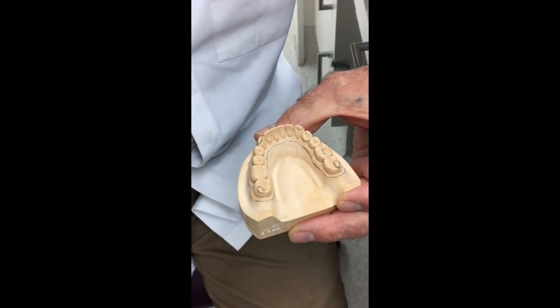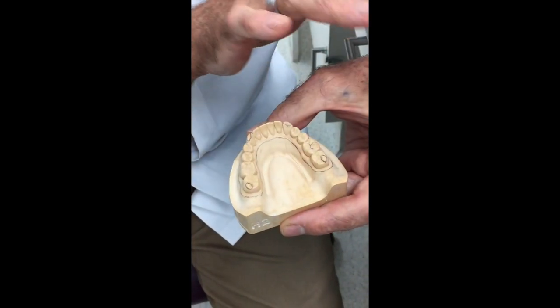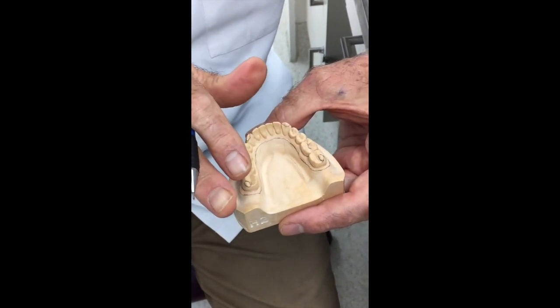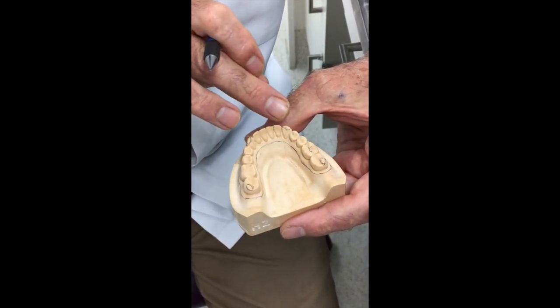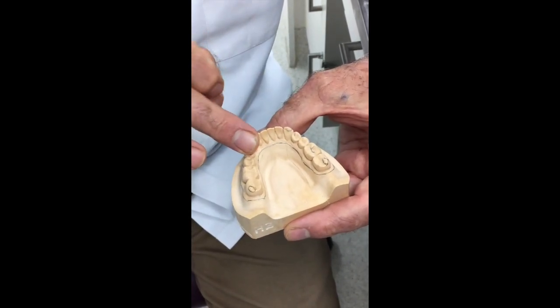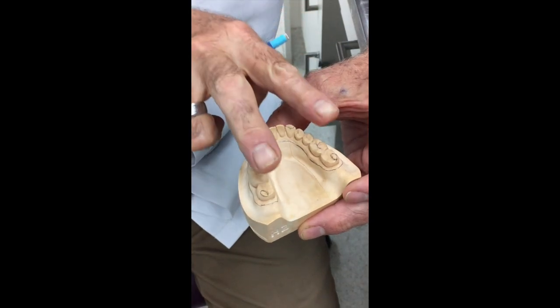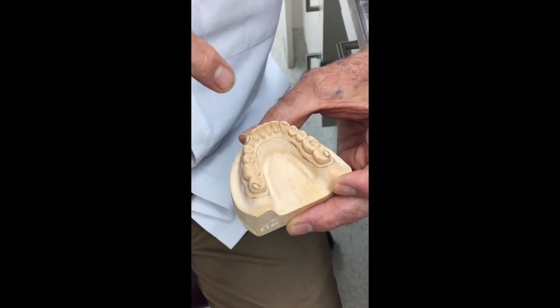because it's just simply like a chair. If you have the legs nice and wide apart at the four corners of the chair, when you sit on it, it's nice and stable. If we had one of these legs over here and you sat on this part, then the chair is going to collapse. It's the same with the tray. We want to be able to seat that tray positively so it engages there.